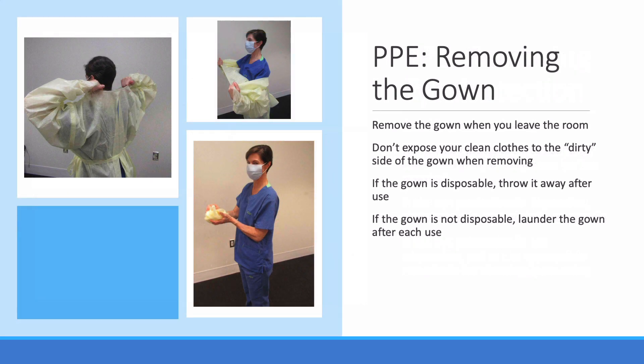Now we'll remove the gown. Remember that the gowns are single patient use. Note that the respiratory therapist removes the gown in such a way that she doesn't expose her clothes to the dirty side of the gown, and her ungloved hands only touch the clean inside of the gown as she pulls it away from her body. She folds the gown over itself for disposal. If they are disposable, throw them away after use. If they are not disposable, make sure they are placed in the identified laundry space for soiled gowns so they can be laundered after every use.